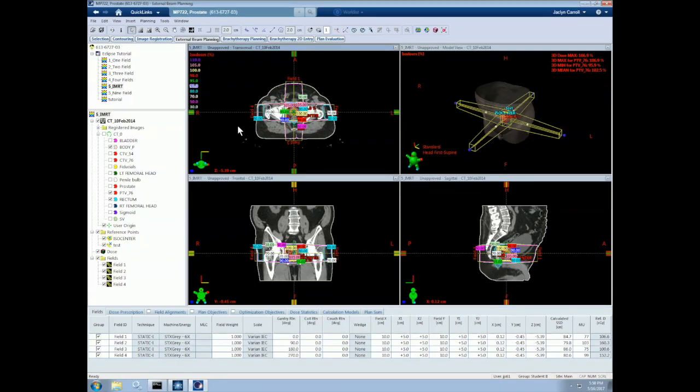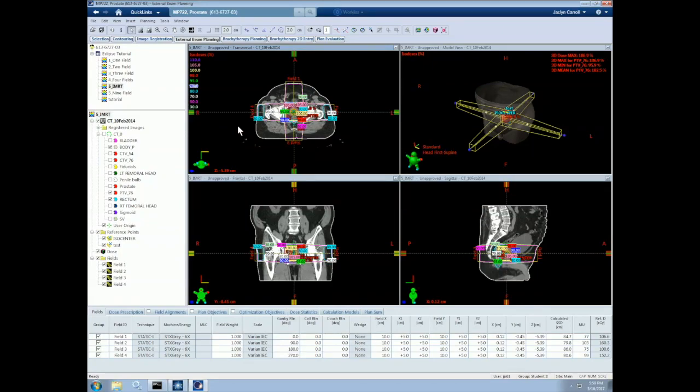Before we get started with our optimization, there are some important special considerations that are necessary for IMRT. First off, we need to be sure to verify the accuracy of our contours. Accuracy of contours is more important for IMRT because the inverse optimization depends on them directly. This is especially true for the PTV and for any organs at risk that are in close proximity to the PTV.